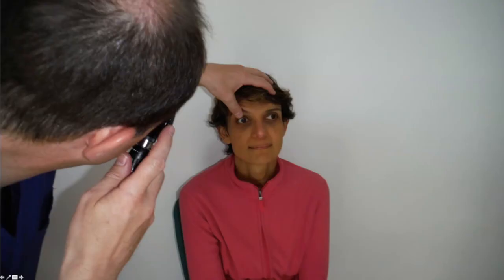When you and the patient are in the correct position, you then need to turn on your ophthalmoscope and hold it hard up against your eye. If you are examining the patient's right eye, hold the ophthalmoscope up against your right eye. You then need to envisage a cone of light going from your ophthalmoscope to the patient's eye.